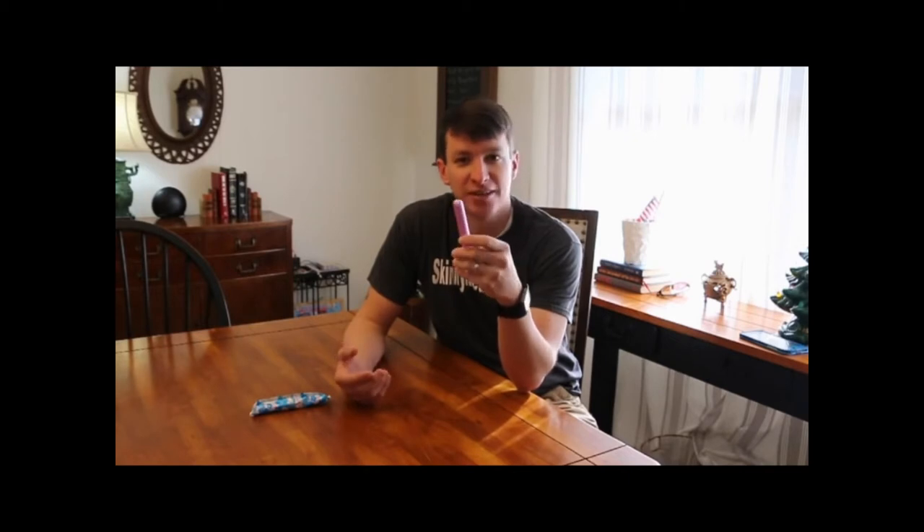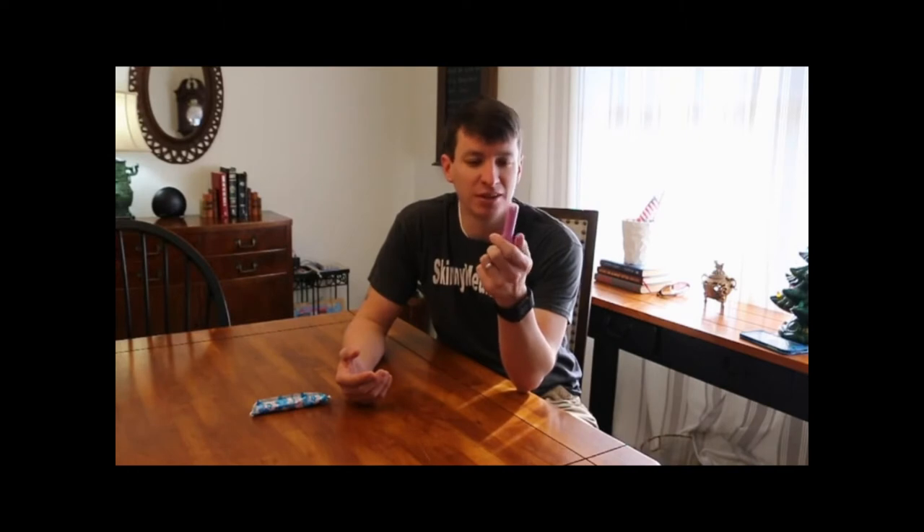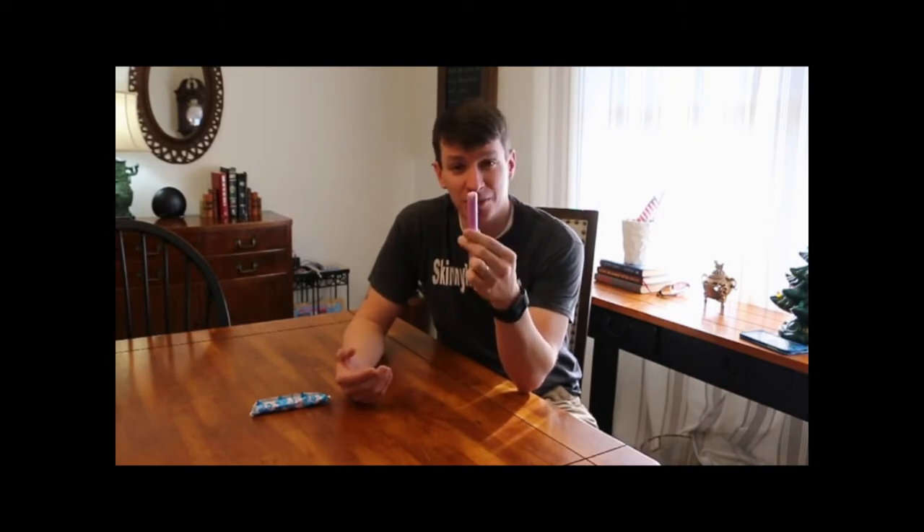It seems like every video that I do talks about bleeding control, hemostatic agents, gauze, something like that. There's comments about using tampons to plug holes, plug GSWs — gunshot wounds — with this product here. So I'm going to talk about it. I'm going to take this apart and show you just how little gauze is actually in here, and show you some other products that are cheaper and just as effective.